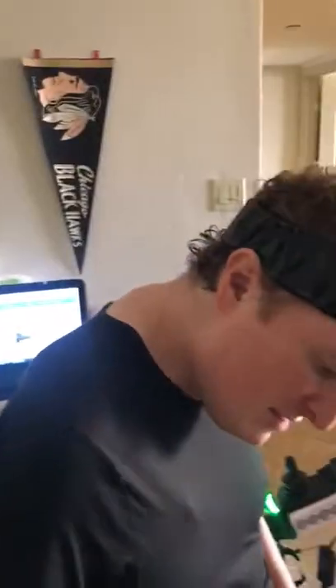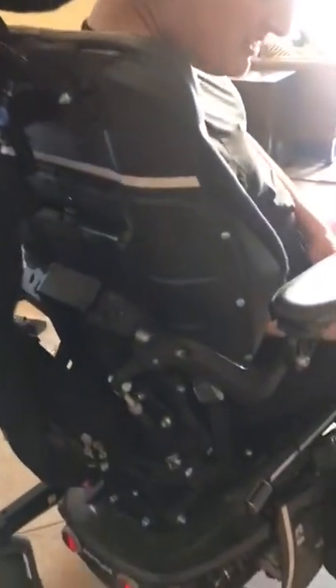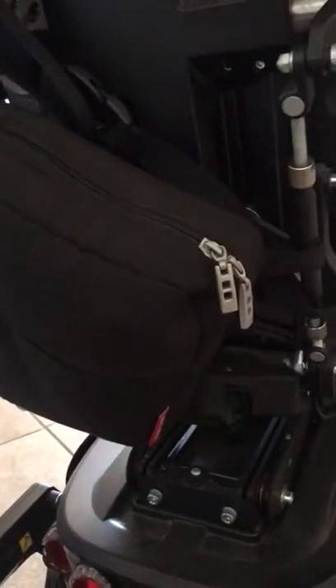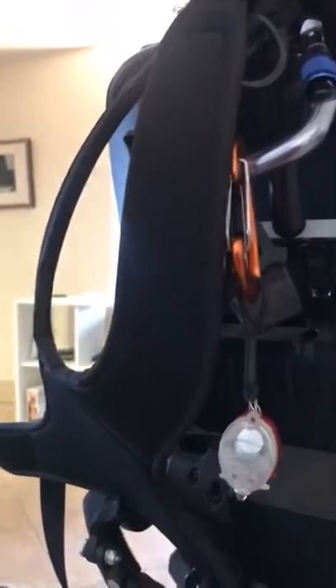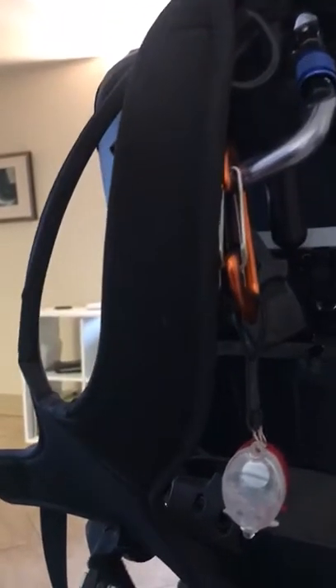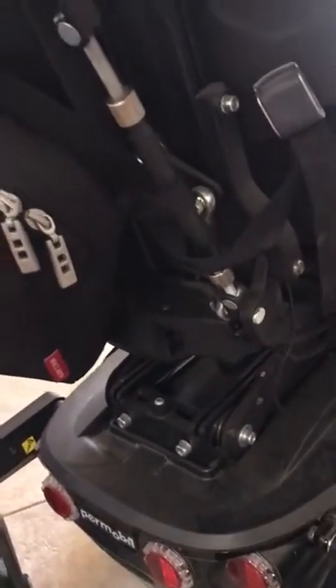On the back of the chair, on the bottom there's a bag that holds things — it's kind of like my purse. Above that there are a bunch of carabiners that I use to hook bags, so I can carry things for other people. There's also reflective tape that helps people see me.